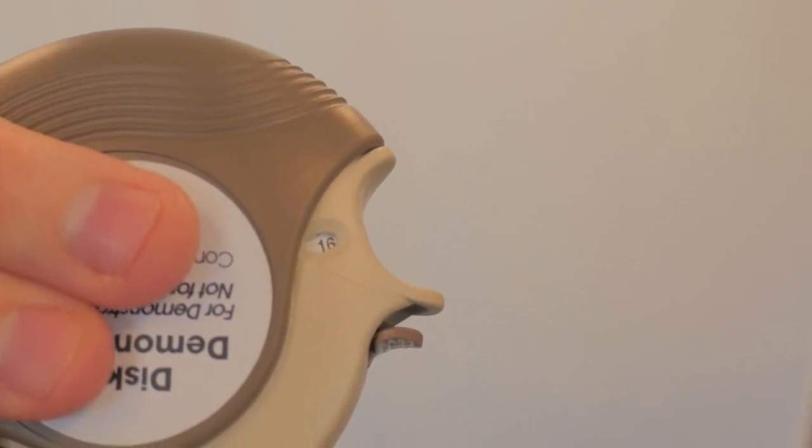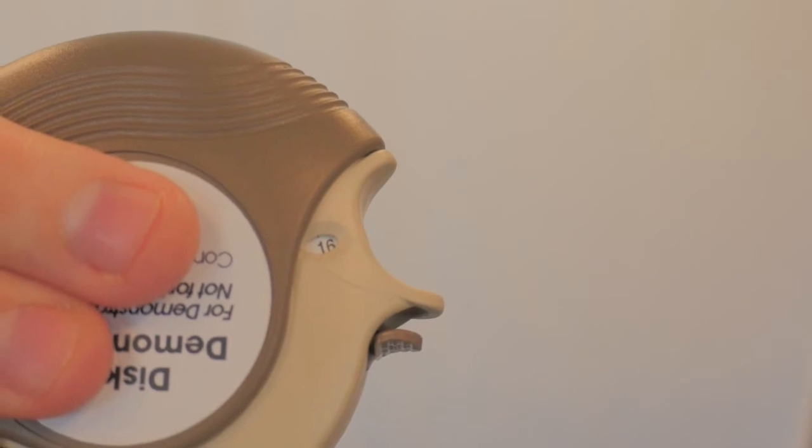It's important that you do not close it, tilt it, or move the lever, otherwise you will waste a dose. Breathe out for as long as you can while you hold the discus level and away from your mouth. Don't breathe into the mouthpiece.